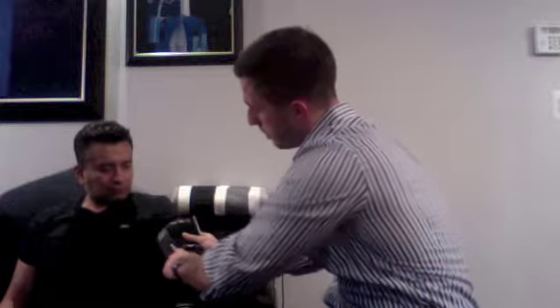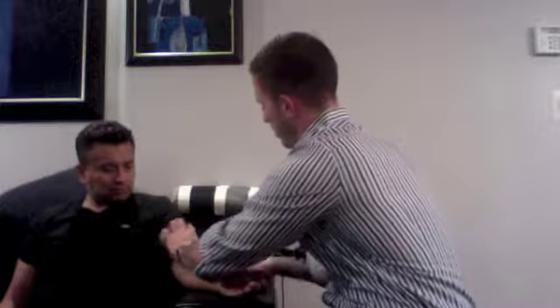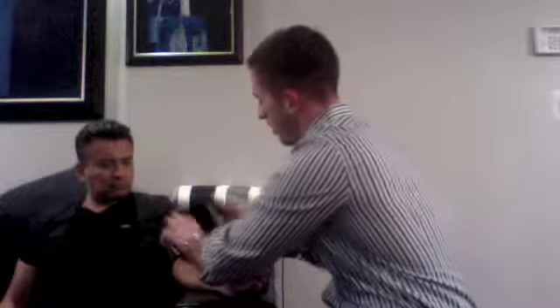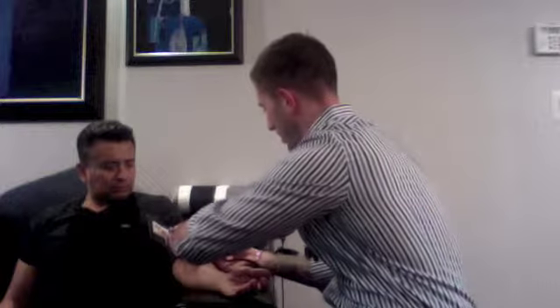So now we'll line up the blood pressure cuff. You want to make sure the artery marker is in the brachial artery, which is located right here. So you put that on, put it on there. Not too snug, but you want to put it on there. So we'll clip this down here so we can read it.